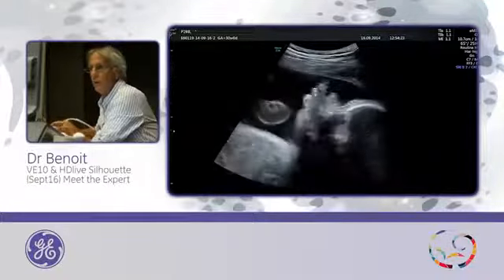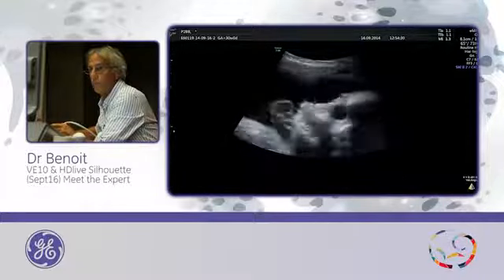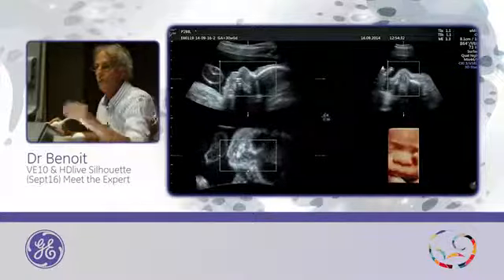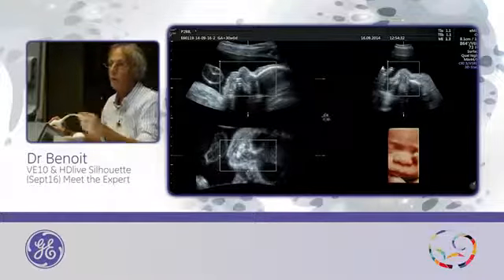But if you do this, you need a foot switch. And I always work with a foot switch. Start. And today, Roland is my foot switch. So this is the result. So if you don't use your two hands, you cannot obtain such a picture. Only if you are lucky, but you have to move the baby.